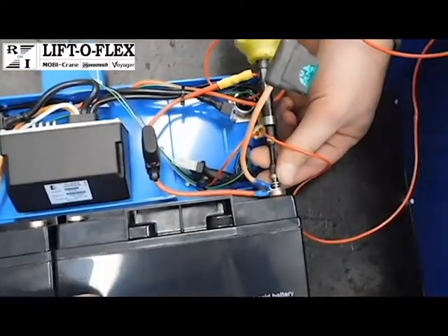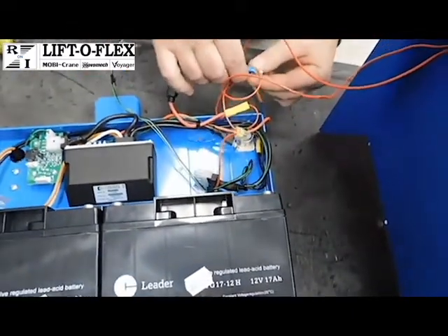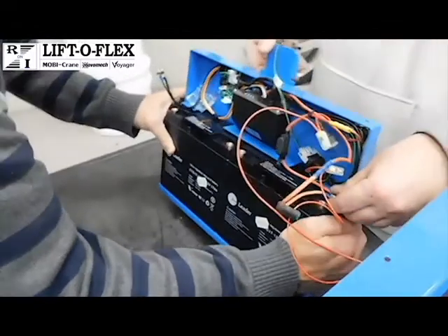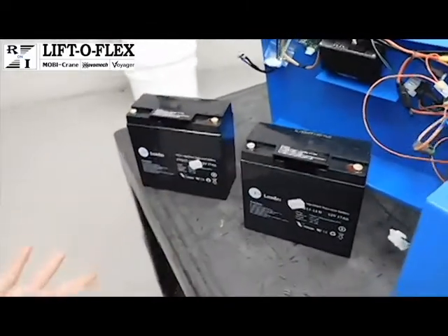The spare batteries are the batteries only, so all the hardware and wires will have to be kept for the next set. That releases the batteries. They can then be pulled out, which is done a little bit easier if the power pack is sitting up. The batteries just slide out. So this would be a spare set of batteries.